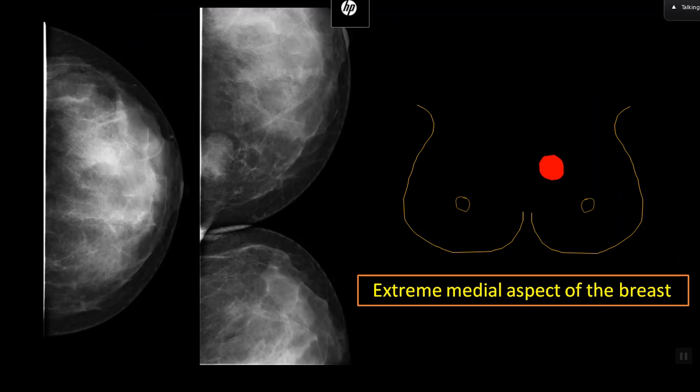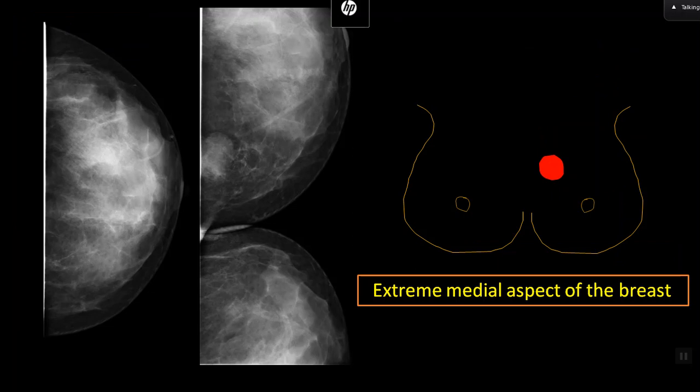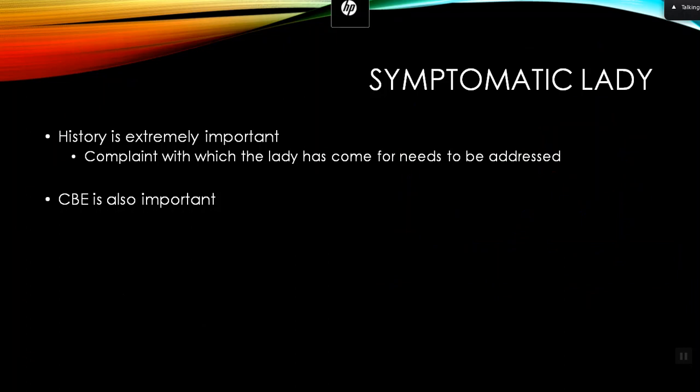The mass was in the inframammary fold — you would never see it otherwise. When it is high up in the breast or in the cleavage, it is not included in the routine CC view. Ask the lady where the mass is, try to demonstrate it on mammograms, and if you can't, do a targeted ultrasound. Write in your report that the clinically palpable lesion in the chest wall cannot be included on mammograms due to its location, and a targeted ultrasound reveals this finding.